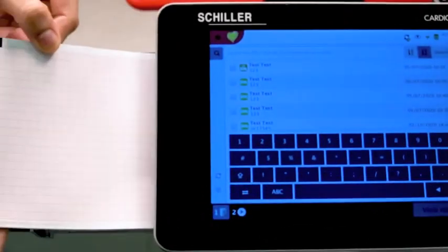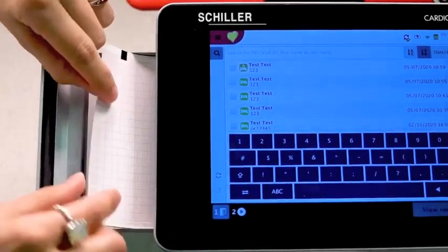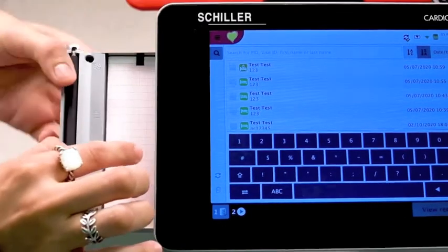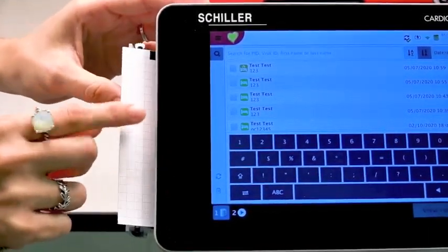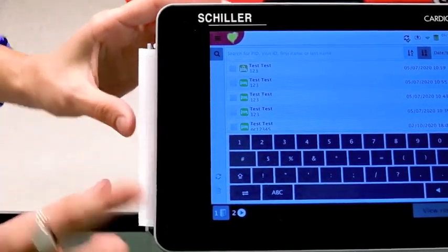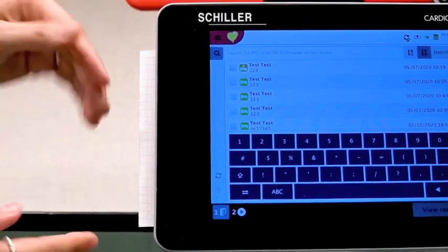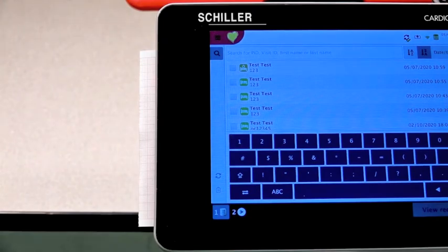So we're gonna go ahead and grab this pack of paper, slide it into the paper drawer. Now it's important to lift up that first sheet of paper and gently start sliding the paper drawer and slightly tug on the paper. And while you pull it out, press into the paper drawer, securing that it's closed, and leave a little bit of paper hanging out, okay? Now you have properly replaced your thermal print paper.